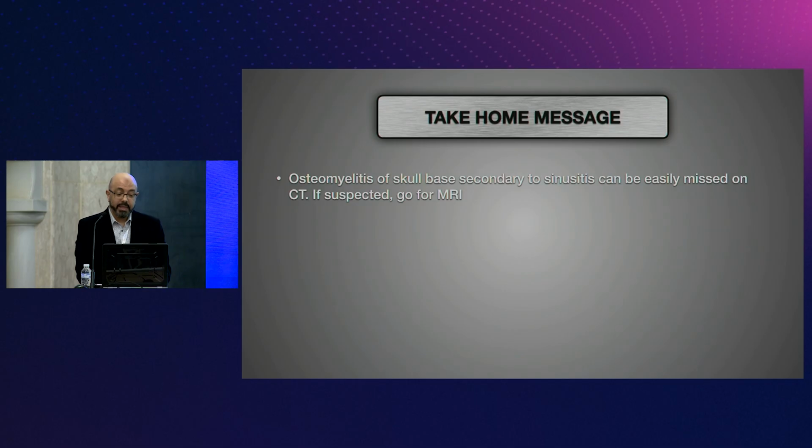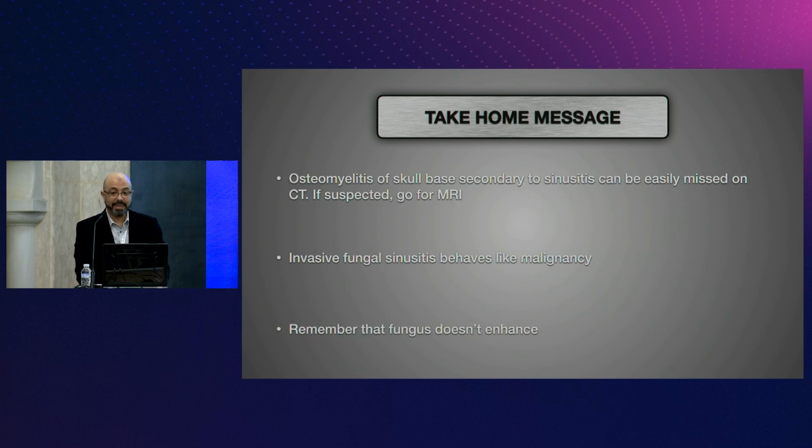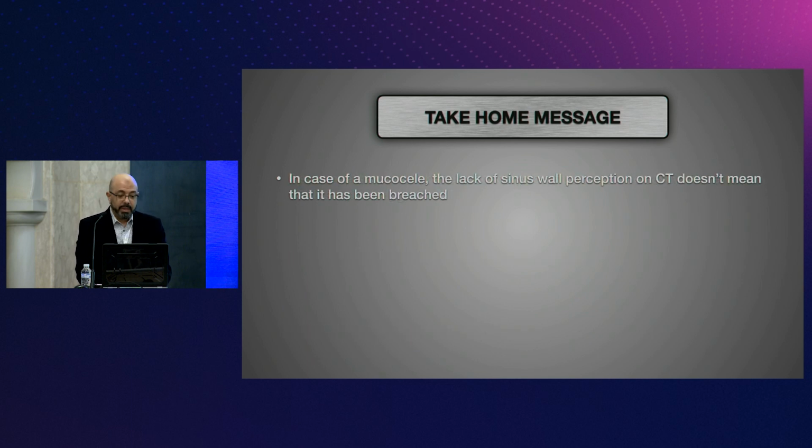Osteomyelitis of the skull base, secondary sinusitis, can be easily missed on CT. If you suspect it, just bring the patient back for an MR. Invasive fungal sinusitis behaves like cancer, but always remember fungus should not enhance, cancers will. In case of mucocele, the lack of sinus wall perception on CT does not mean that the wall has been breached. Most of the cases, the wall will be completely fine, but you can't see it.